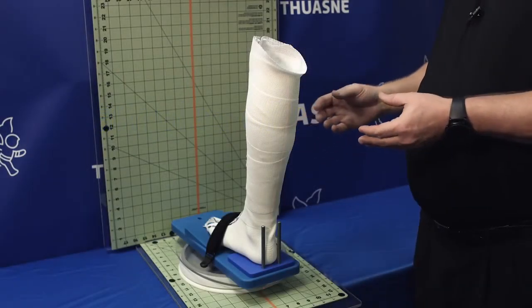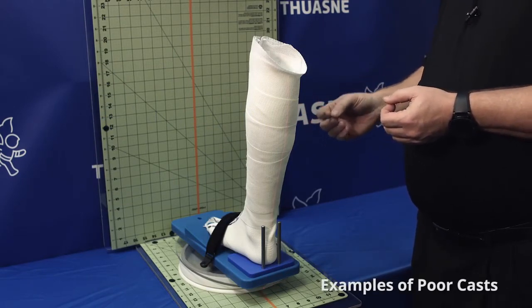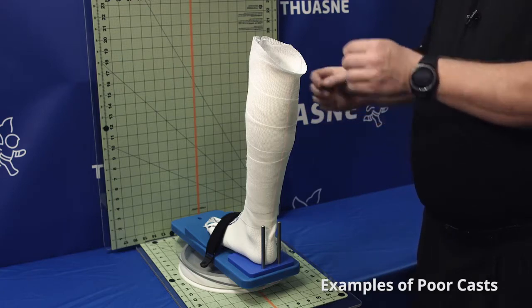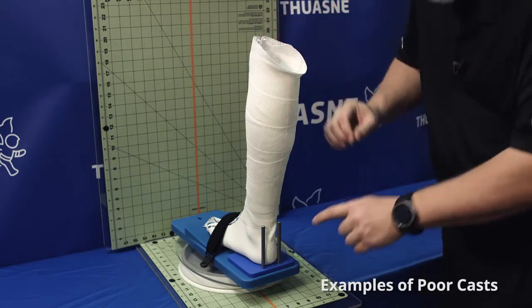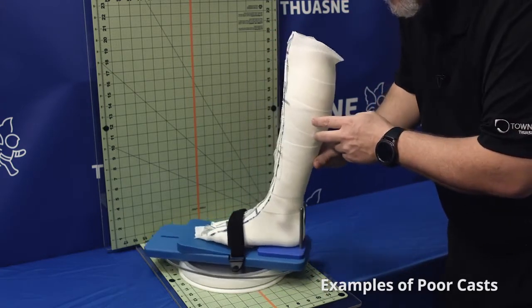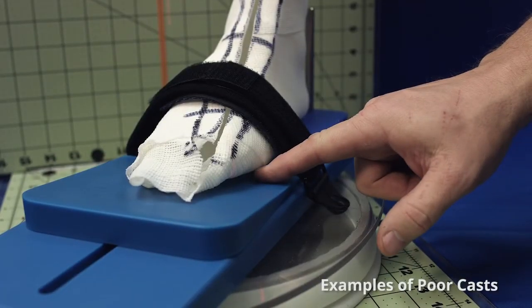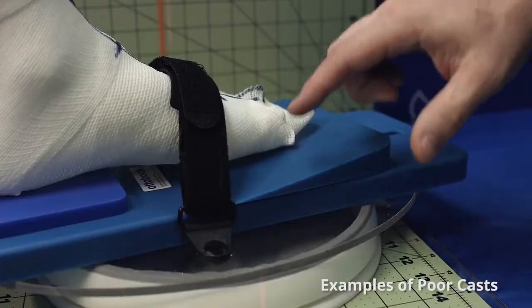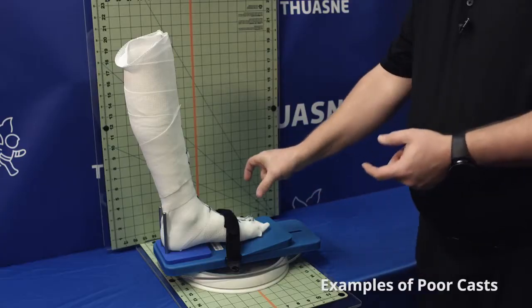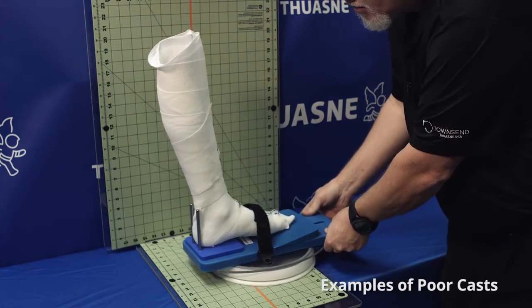In this negative model, we're going to demonstrate bad sagittal alignment. Unfortunately, this alignment would be catastrophic to the function of the vector device. You can tell that the hind foot is correct, and when we spin, we're going to look at the forefoot. There is a gap here, but there's also a gap on the first as well, and those gaps are actually even.